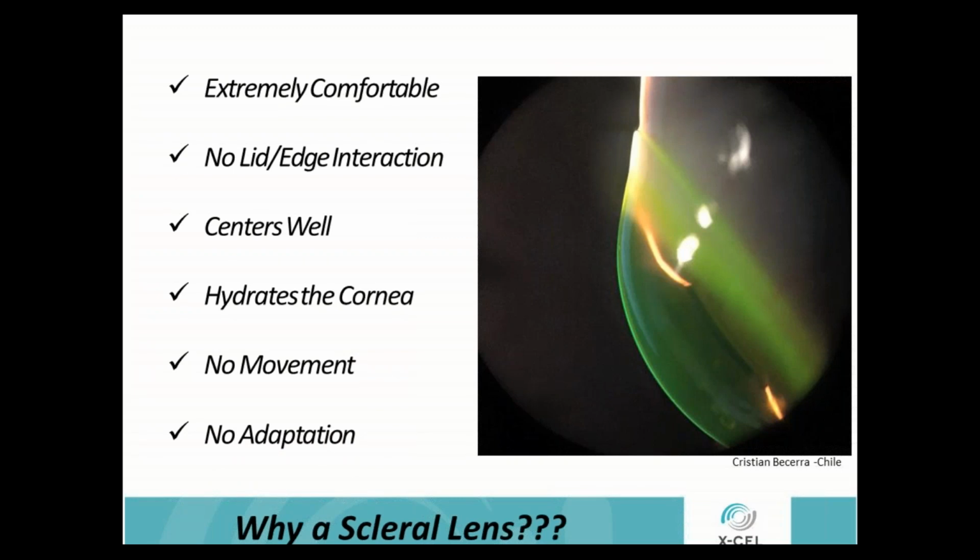And another nice thing that we don't always associate with sclerals is, when we think about the adaptation period of a corneal GP, we will have a patient wear the lens the first day for a couple hours, the second day add a couple hours, and then we incrementally add on wearing time. And after about 2 weeks, they can wear a lens for a full day if it's a corneal GP.